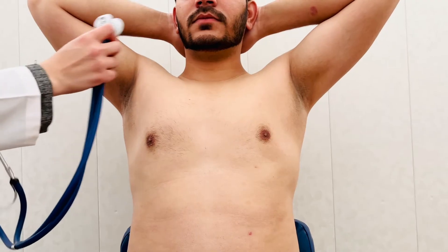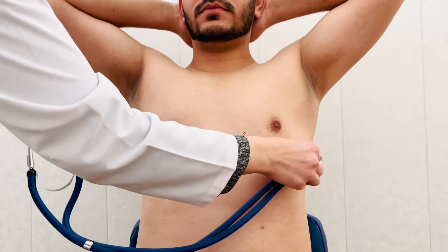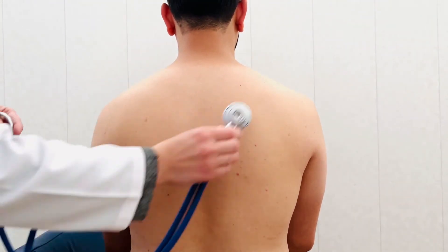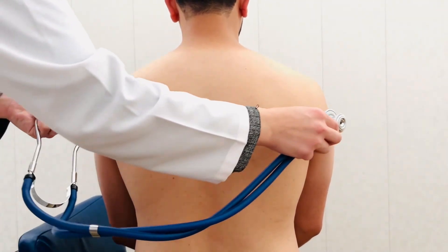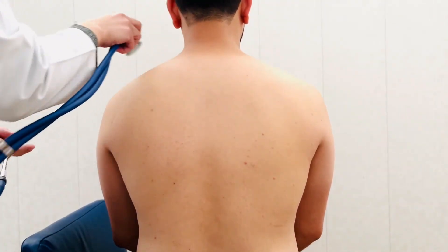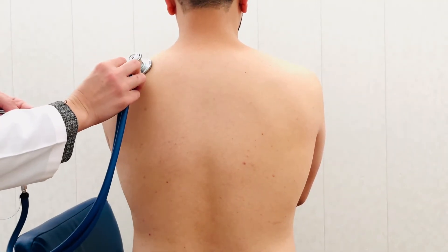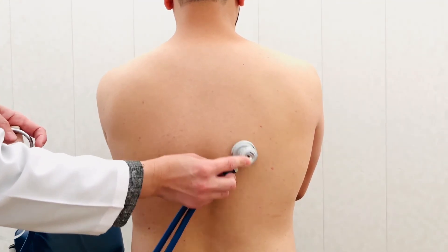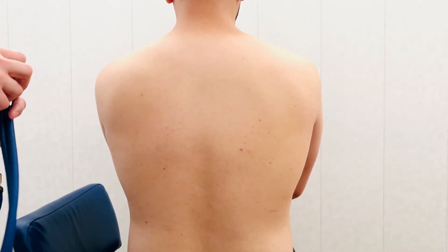The axillary region can be listened to by raising the hands above the head. On the back side, we should listen around the scapula. To expand the interscapular spaces, the patient should cross their arms on their chest. This expands the suprascapular region, interscapular region, and infrascapular region — all auscultation points for vesicular sound.